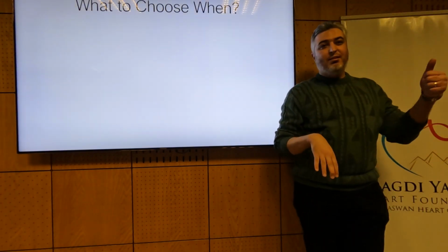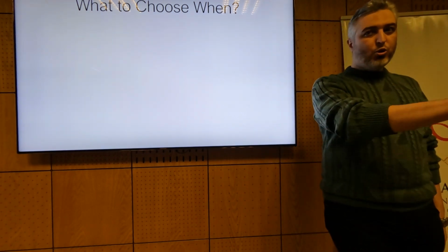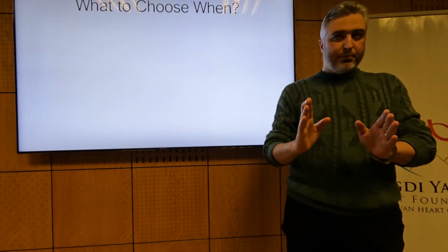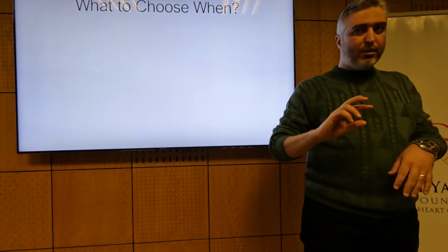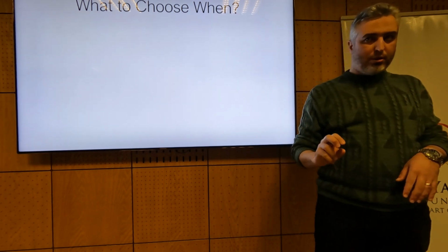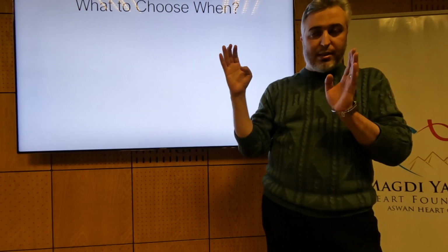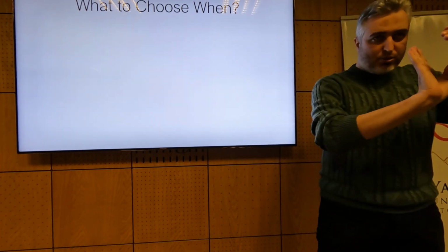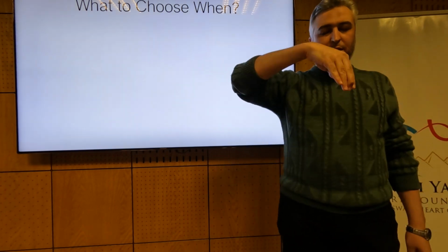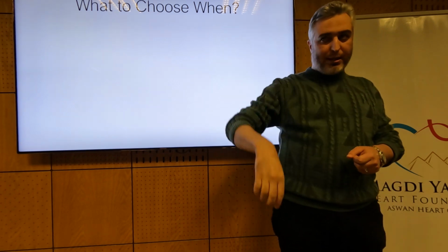So I've discussed AAI: atrial sensing inhibits atrial pacing. AOO, very limited use. VVI: ventricular sensing inhibits ventricular pacing. Safe, protective, yet unphysiological. VOO should absolutely not be used unless in a very limited scenario; it is very dangerous and can lead to VF. Do not turn the VVI into VOO by setting the sensitivity to maximum.